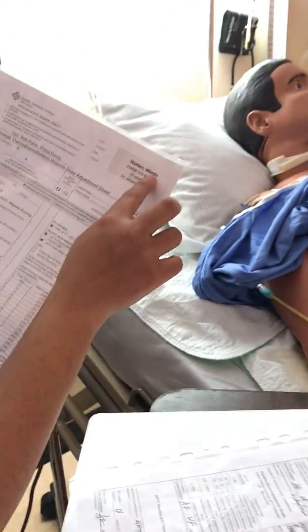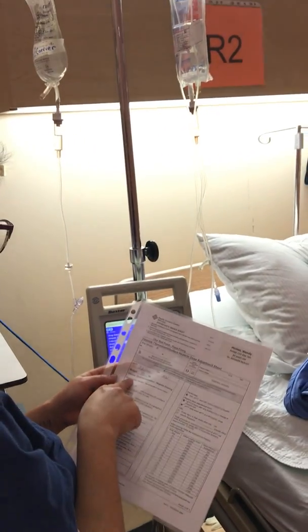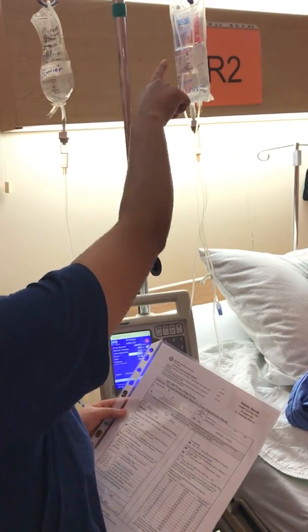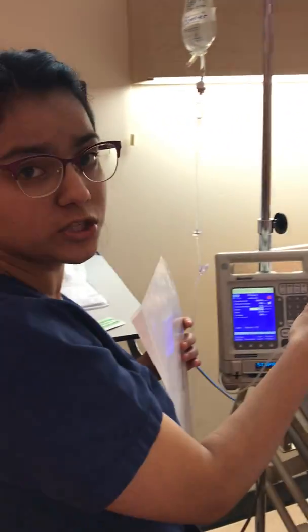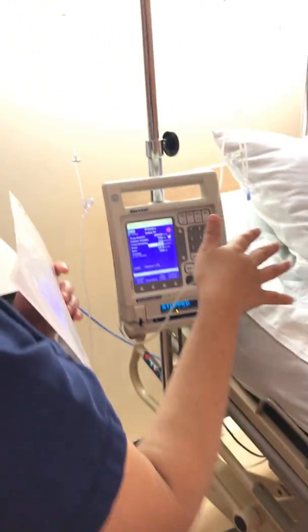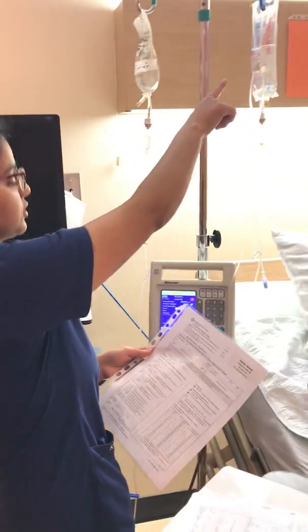I have the right patient, Wendy. I see her bracelet, Wendy, and the name on the bag. I see that I have the right drug, heparin. I have the right dose, 25,000 units. I can see it's the right route, which is continuous infusion. The right time is now. And I can also see that my rate is 1350.